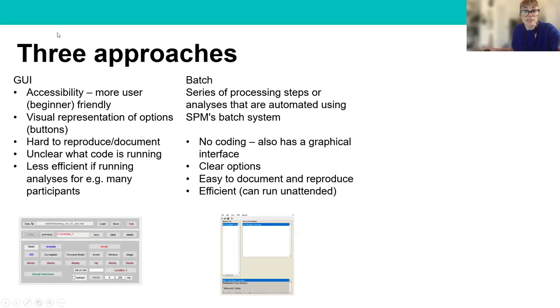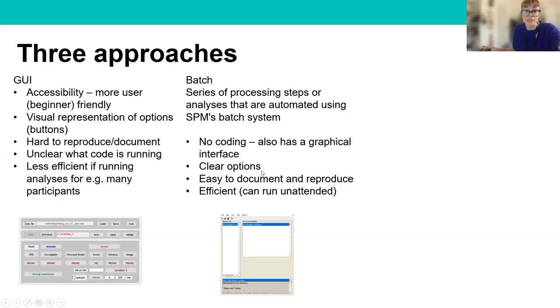The second option is the batch — a graphical user interface where you can string together a series of processing steps that have been automated. The advantage here is you don't have to write any code, the options for the analyses are quite clear with drop-down menus, the analysis is easy to document and reproduce because you can save the batch, and it's quite efficient because the batch can run unattended.